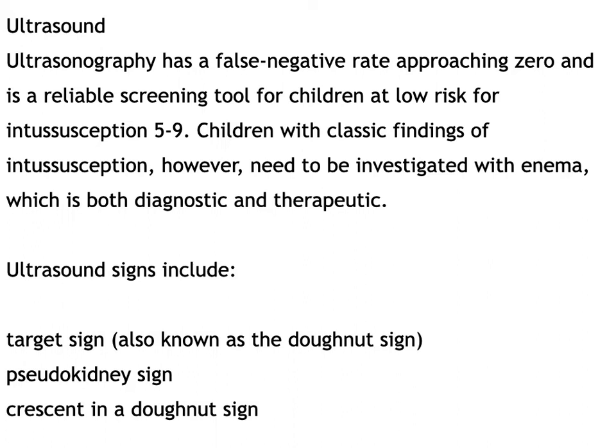When you receive your report, the first thing you want to look for is the ultrasonographer's mention of a target sign. As soon as you read this target sign, you are in the presence of an intussusception. The clinical picture of this kind of disease is very classic as well, but with this confirmation from the ultrasound, there is no doubt it's an intussusception.